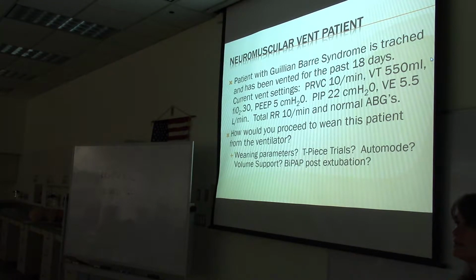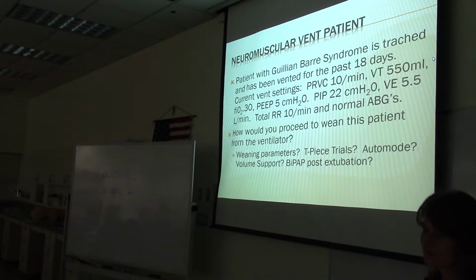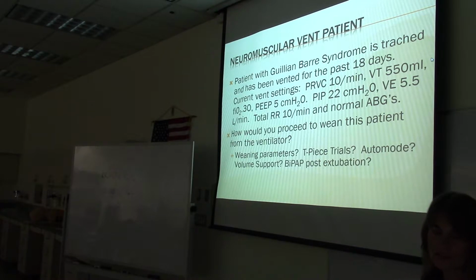That way they work more than just, right on. Yeah, they have to work to get the air. Especially this patient is trached already, so. Mm-hmm. And then just wean the SIMV rate every day? Okay, yeah, that's a good suggestion.